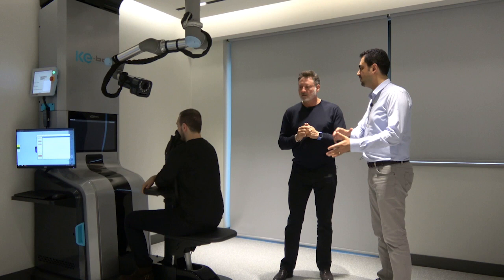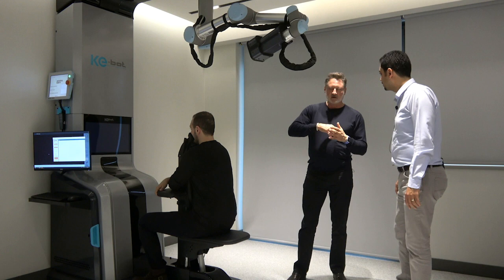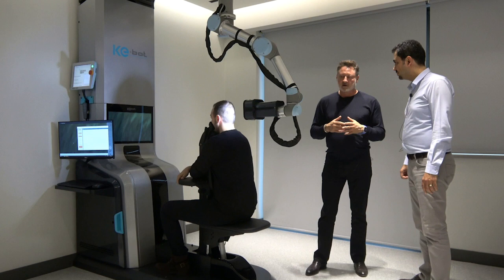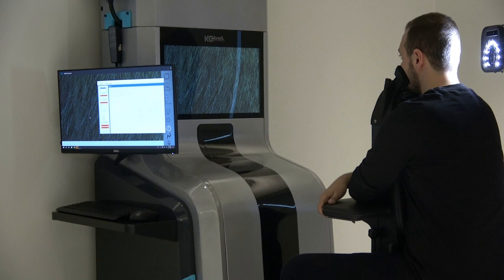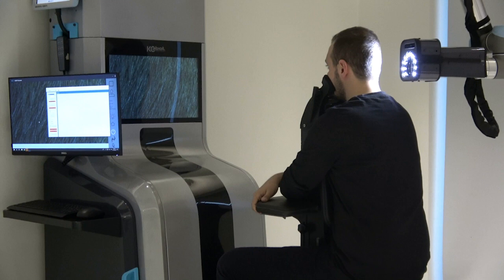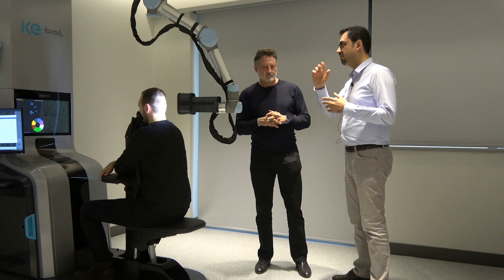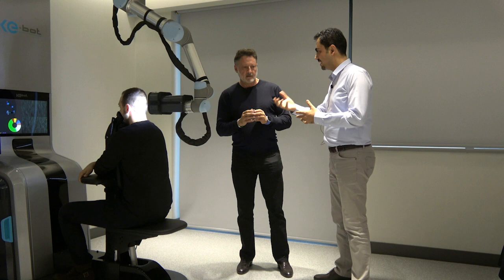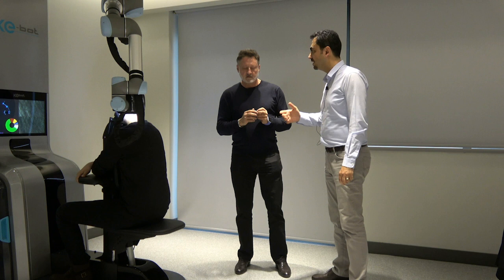We will separate the post-op stage into two phases — five minutes for the donor area and five minutes for the recipient area. That's an important modification: previously, imaging and 3D modeling were all done at once and took much longer. After generating the 3D model, we position the robot and capture more than 400 images — a huge amount of data. We are making modifications to reduce this time without sacrificing counting or measurement performance.